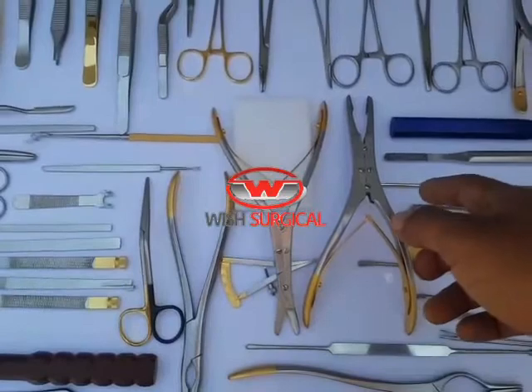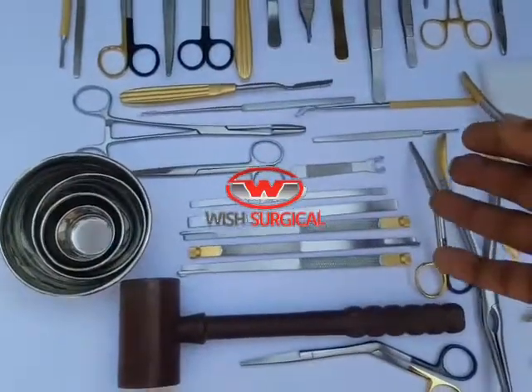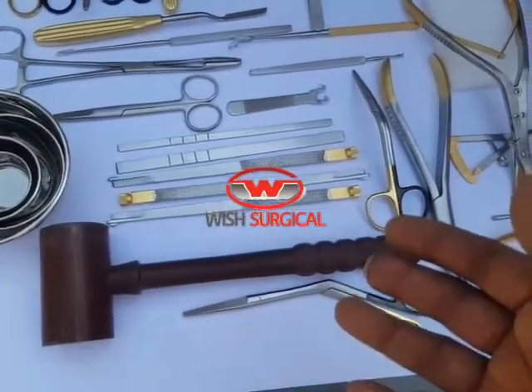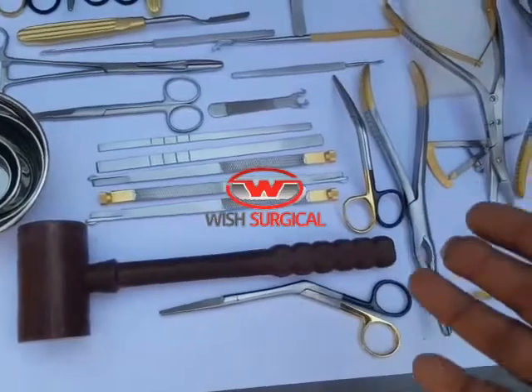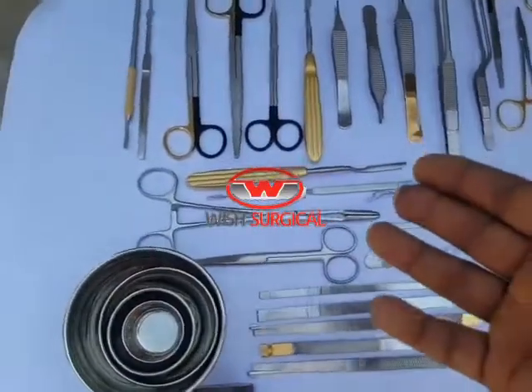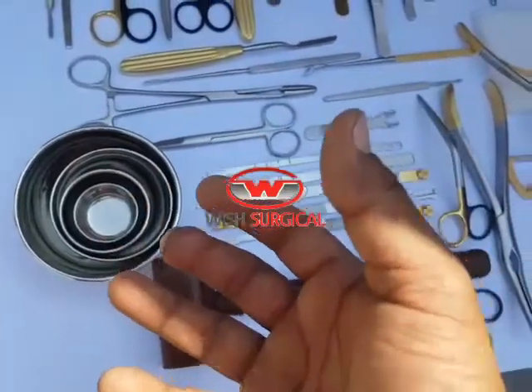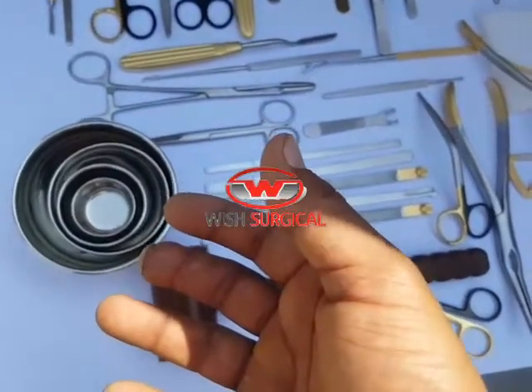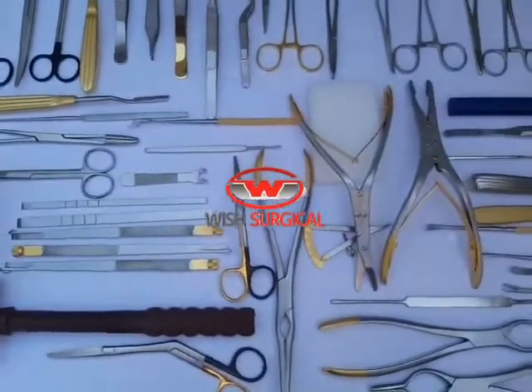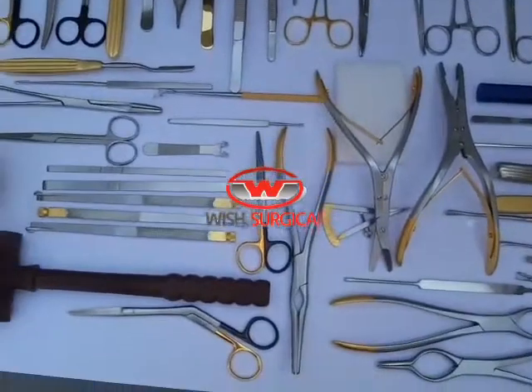Gold pan scissors, TC septal forceps — here you can also see total Gubish osteotomes, dorsal scissors, Heyman scissors, Freer mallets, dressing forceps. And here a set of four bowls: 20 cc, 60 cc, 160 cc, and 400 cc. All instruments are made with French steel and very fine cutting edges.